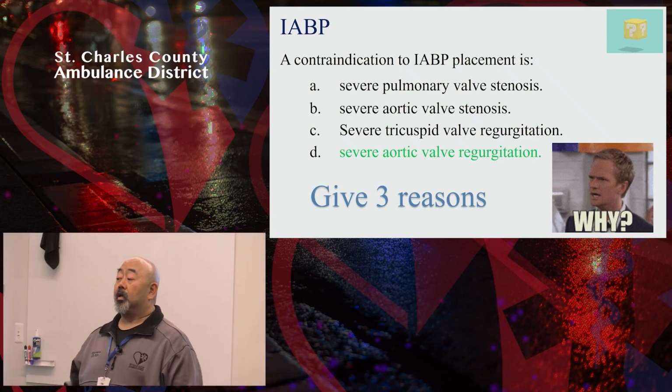Assuming your transducer is there. In other words, it is possible to have pressure wave transducers anywhere along that route. But the further away you get from the aorta, the further the dicrotic notch moves, and the less pronounced it becomes, to the point where once you get down to about the iliofemorals, you don't even have a dicrotic notch. Not because you don't have one, it's just because you're too far away from that pressure wave from the aortic valve slamming shut. So your timing gets moved proximal as your transducer does, because what you're measuring is a pressure wave. Does that make sense? And the amplitude of that pressure wave gets less and less, to the point where you lose it the more distal you are from the valve. Cool stuff, right? So just remember that's what you're assuming, and that's where most pressure wave transduction is done, near the aortic arch, because that's what you're measuring.